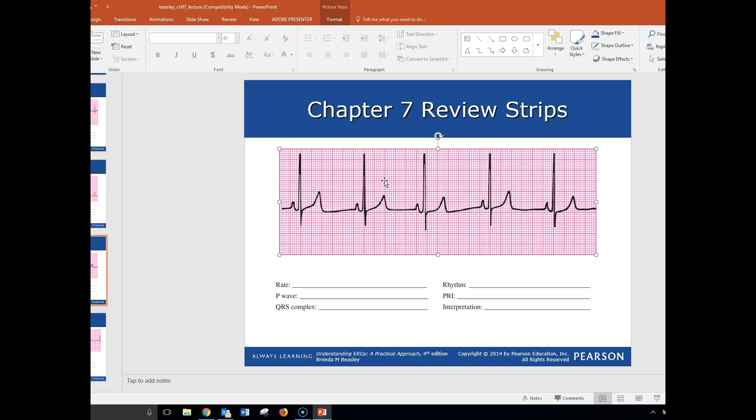We got 50 showing in a six-second strip, as well as using our 300 method, we were able to determine that that's at 50. Once again, because I messed up the first time, we're going to start here at 300, 150, 100, 75, 60, 50. And that is a 300. I don't know what we'll call that, but it's using the 300 numbers to determine your rate.